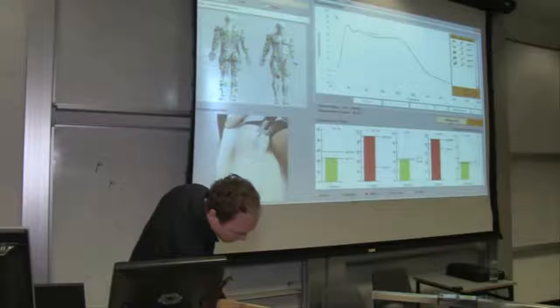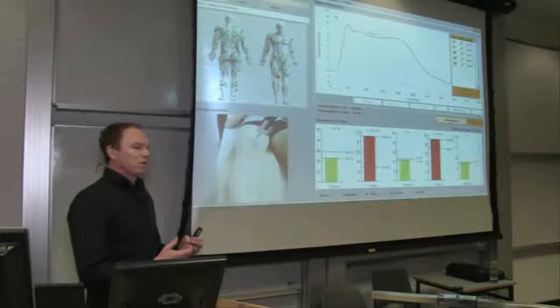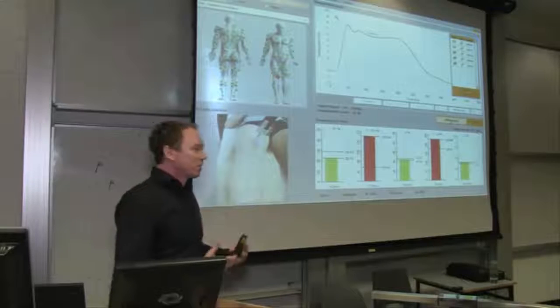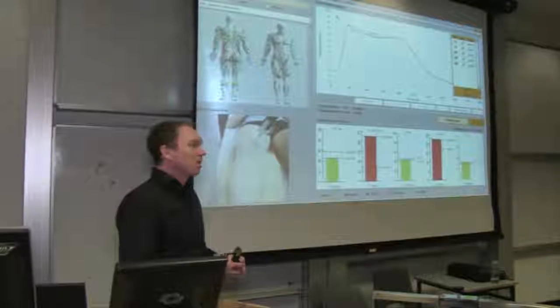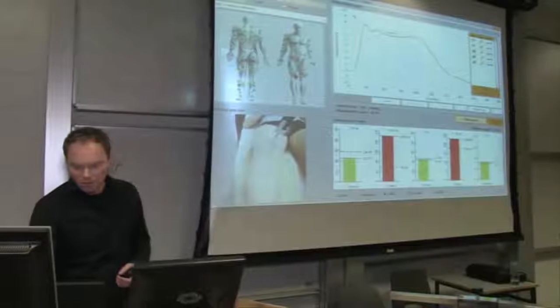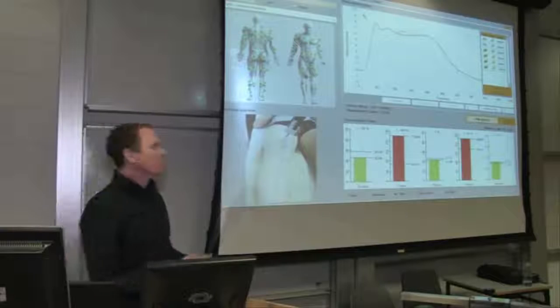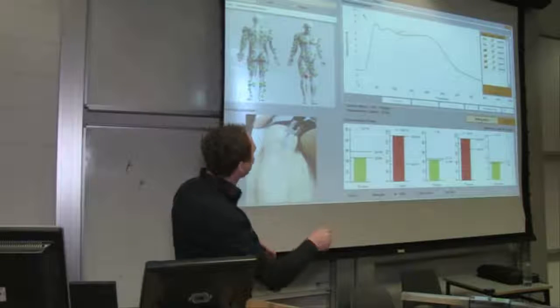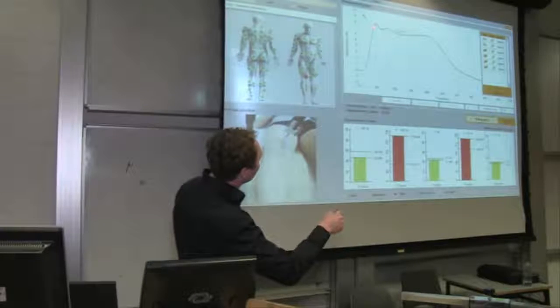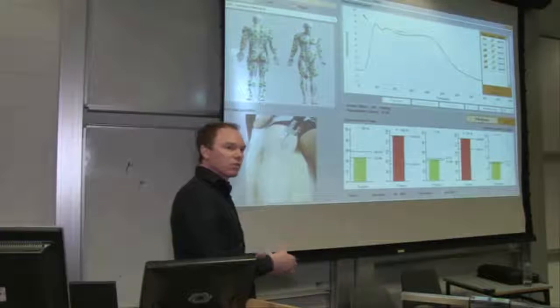Could you just explain why you don't want to see a change? Because if there is a change, that means that I still haven't reached the maximum response, and I want to get the maximum. Okay, let's try one more. So I increased it by the next step. I went to 55 now, and there is no change. So 40, 50, 55, all the same responses.